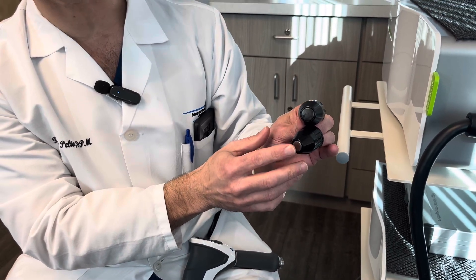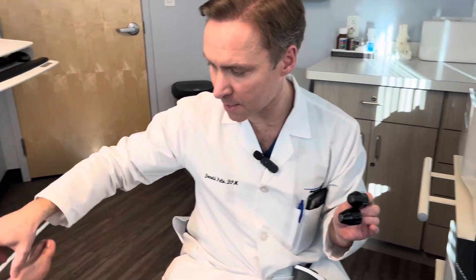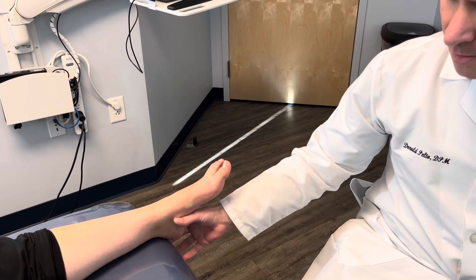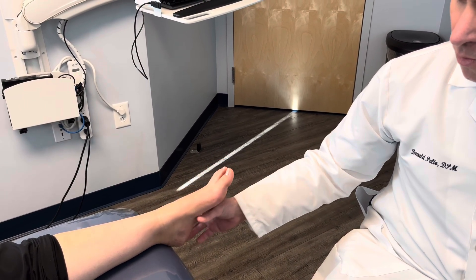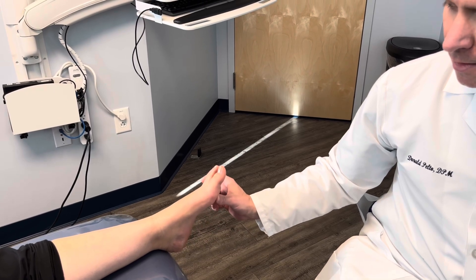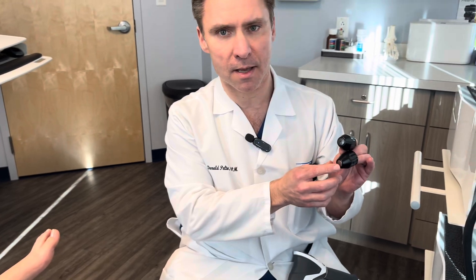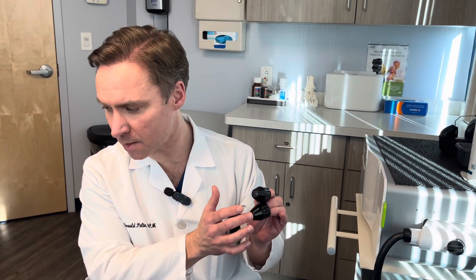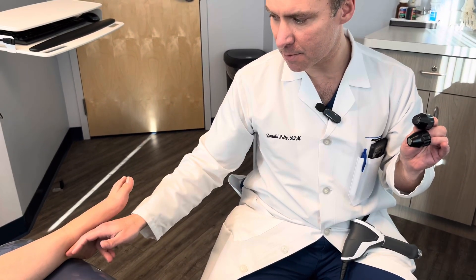The metallic tip hurts more. So if you're doing an area such as a bony prominence — like the navicular tuberosity, the posterior insertion of the Achilles tendon, or the sesamoids — you have to be careful and might want to use the cobalt tip instead. The metallic tip does a very good job on the plantar fascia, the posterior tibial tendon, and the Achilles tendon.